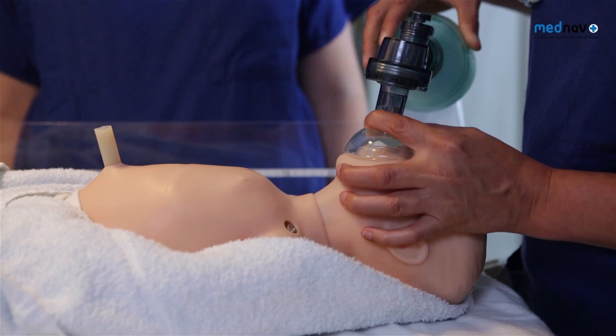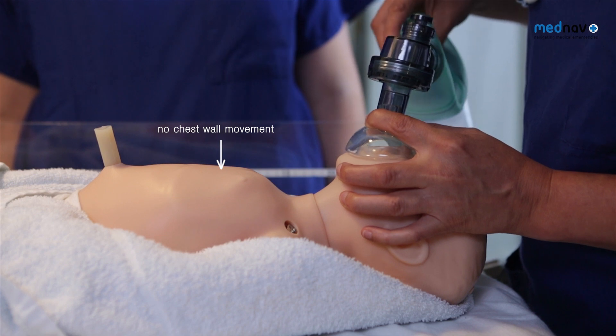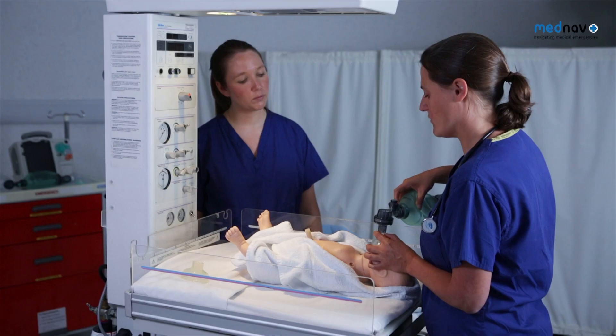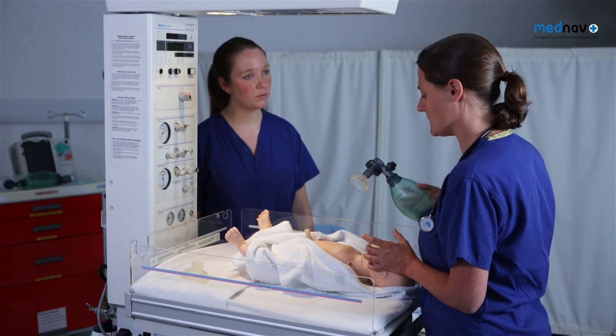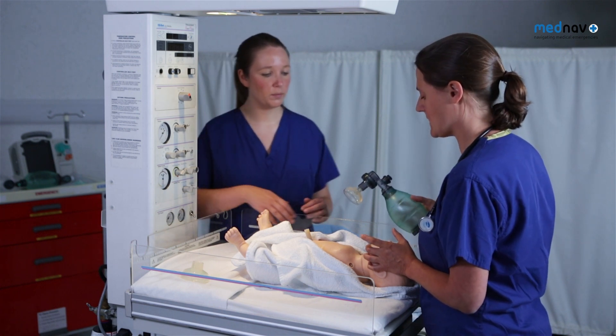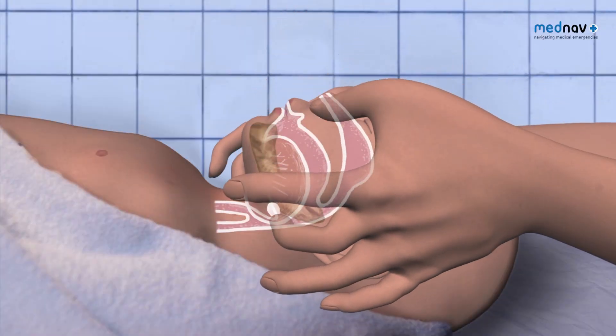Repeat 5 inflation breaths with counting 1-2-3 for each. If the chest wall did not move, or if you have an assistant, you can consider a two-person technique with a two-person jaw thrust and your assistant providing the inflation breaths.